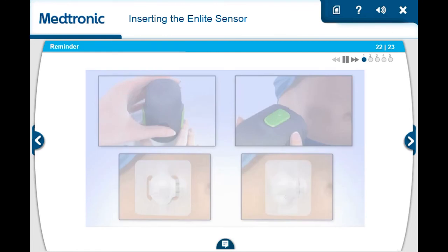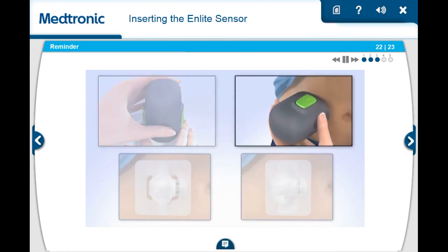To review, remember when you are inserting the nLite sensor: be sure to hold the serter with your thumb on the thumbprint when loading the serter. Hold the serter securely against your skin. Then press and release the small bump on both green buttons to insert the sensor. Apply an additional piece of overtape to the transmitter and sensor.